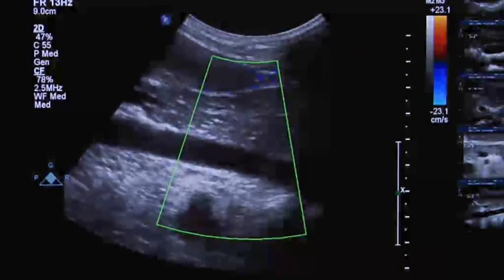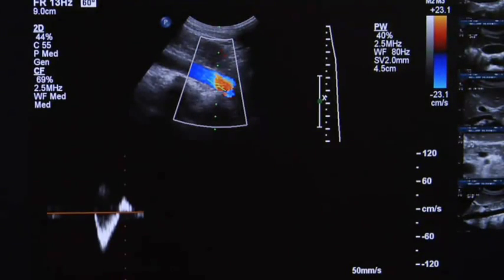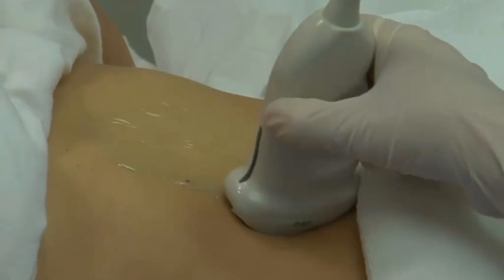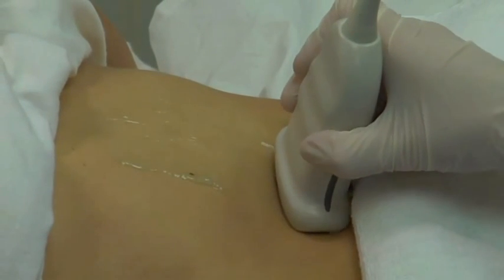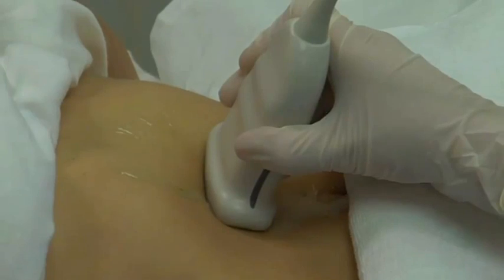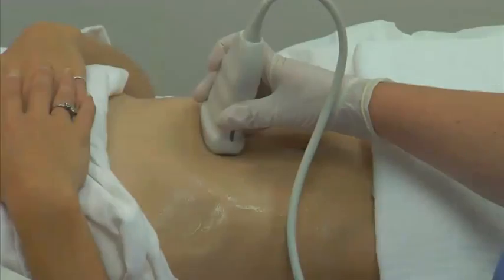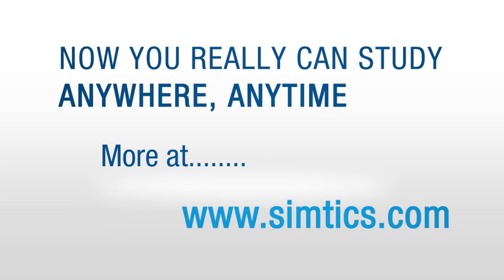Using color and spectral Doppler, interrogate the distal aorta in the longitudinal plane. Rotate the transducer to the transverse plane. Place the transducer below the xiphoid process. Sweep the transducer caudally and slightly toward the left to center the aorta in the scan.